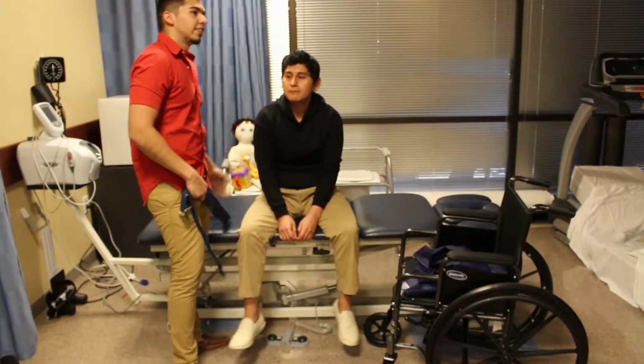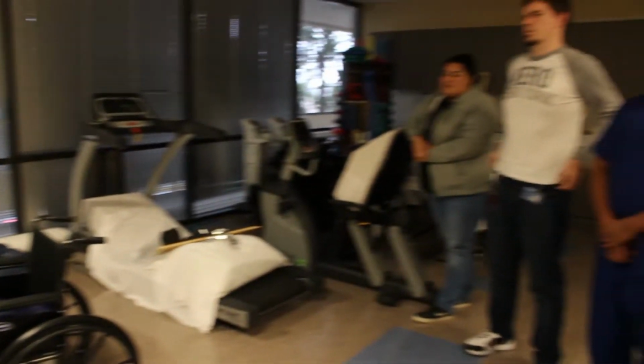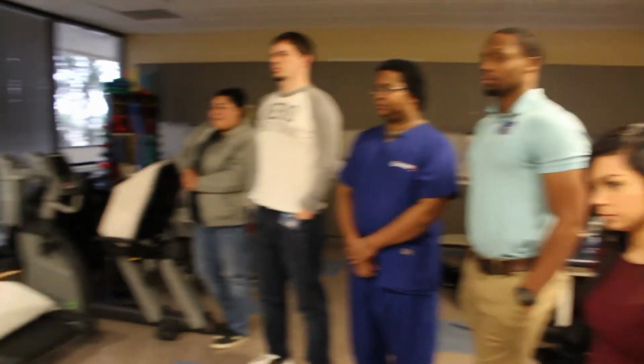Okay, let's say you have the patient already at the side of the bed. The next thing you want to do is put on this gait belt.